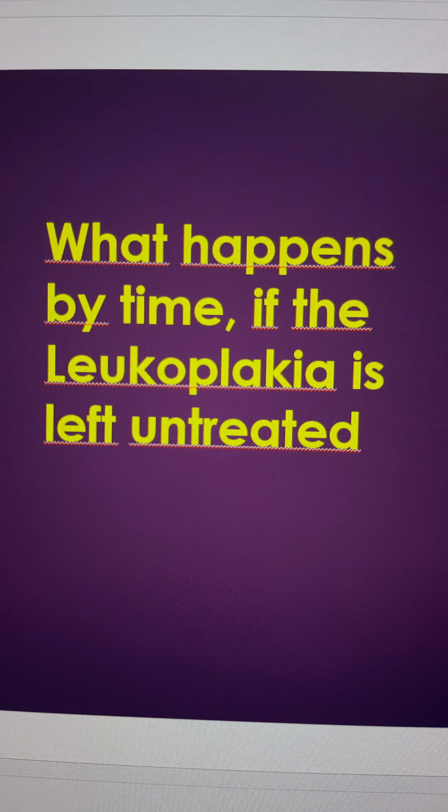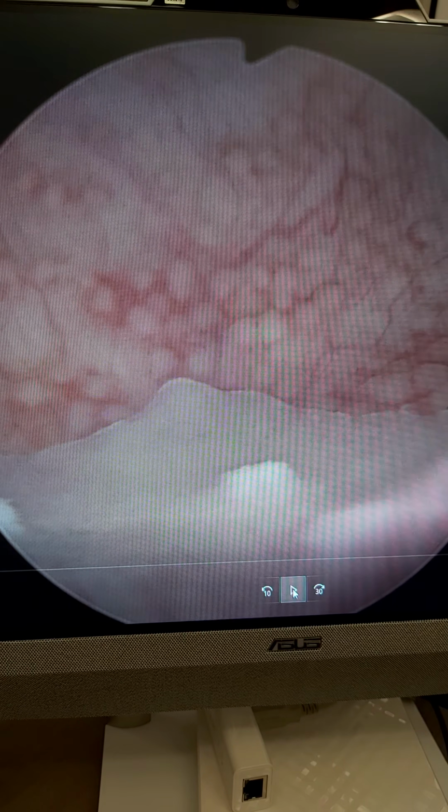In this video, I will try to show what happens over time if we don't treat leukoplakia. I will show the bladder of an old lady who has been in follow-up for many years by other doctors. She had plenty of infections and infective attacks, but she was always treated with antibiotics and she didn't recover; she was never completely treated. So this is her bladder.